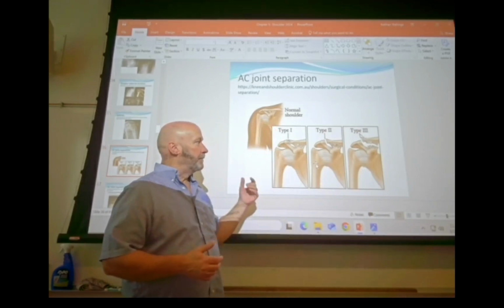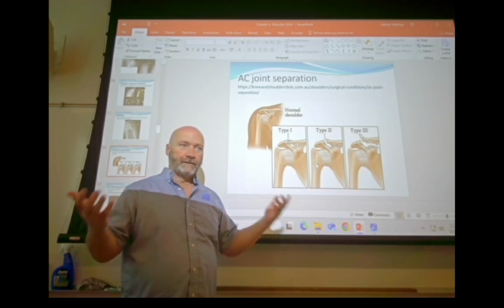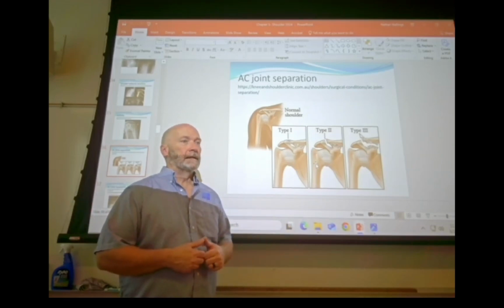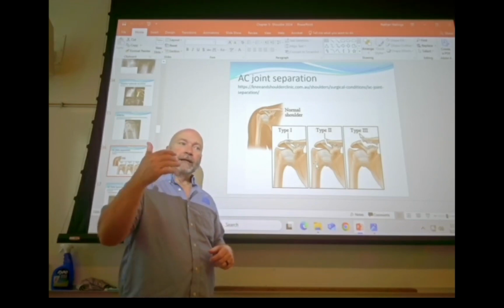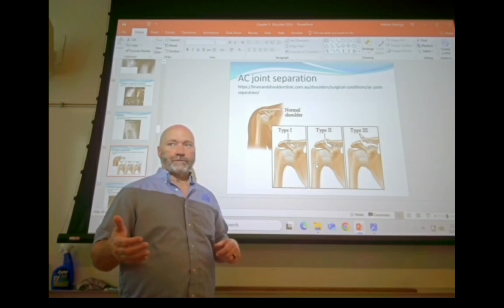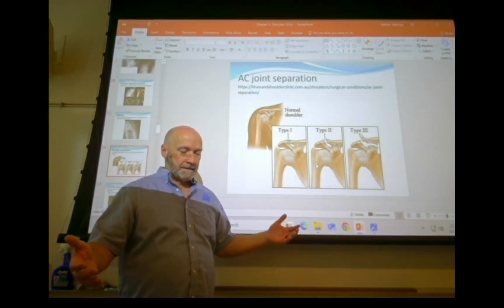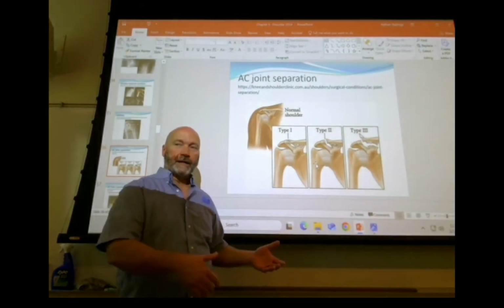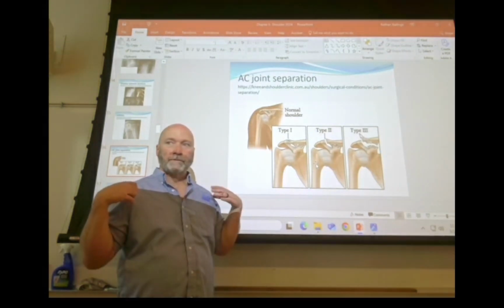The problem with AC joints is that we have a tendency to, if we're not doing chest x-ray or lateral C-spine, what's our SID? 40, right? But anytime you shoot a chest x-ray on a patient, let's say it's a portable chest x-ray, you do an AP and they're supine and you can't get 72 inches, where are those shoulders?